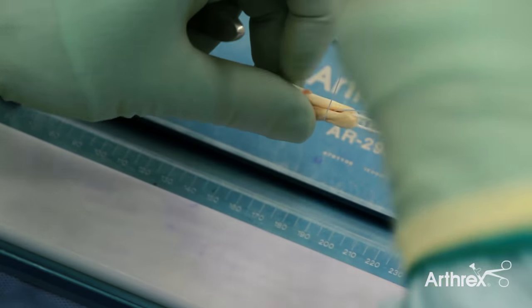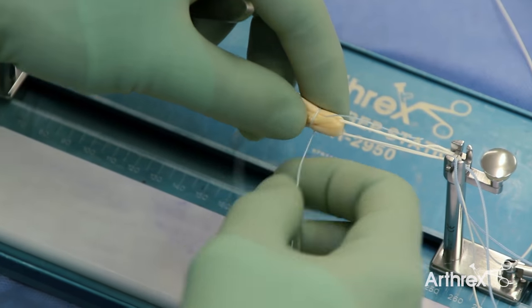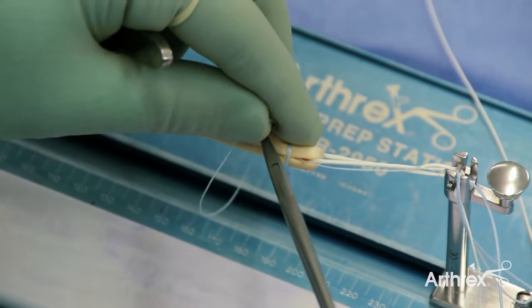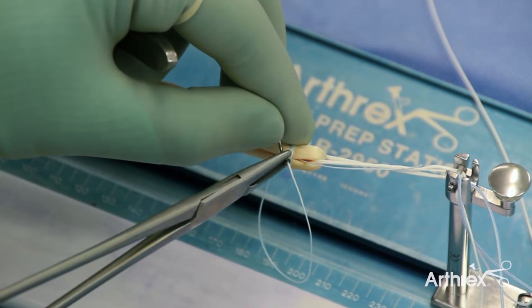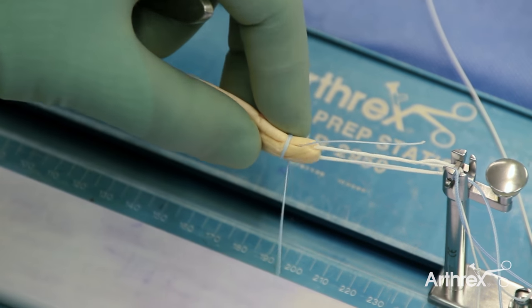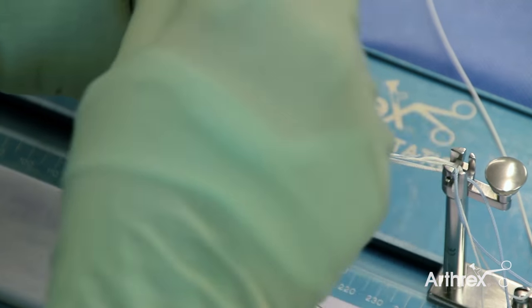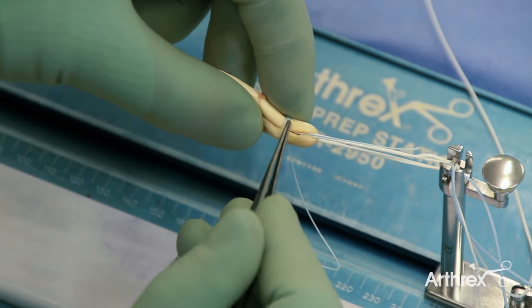We then pass the suture three to four times around the graft. Note that I keep my index finger on the loops that I just made. By doing this, they don't unravel and tension is maintained.